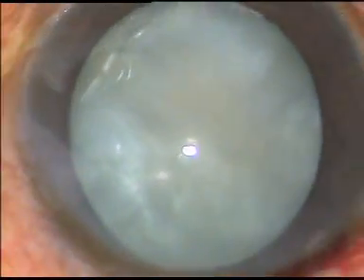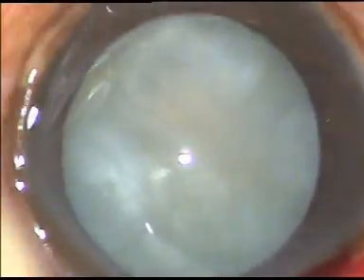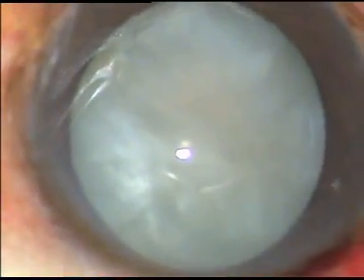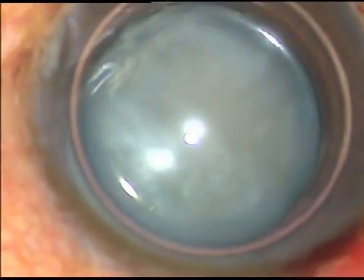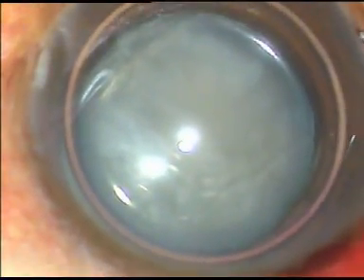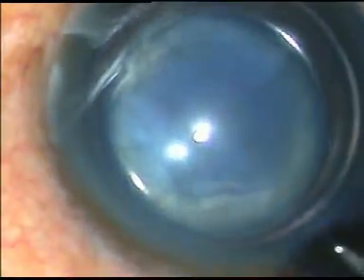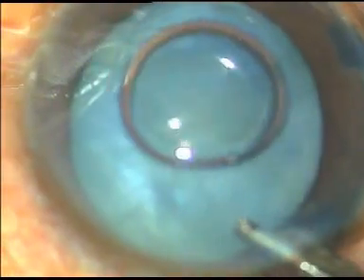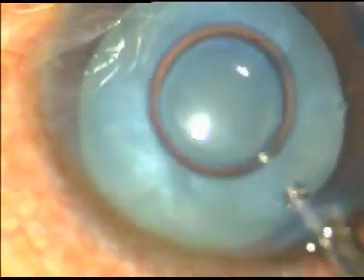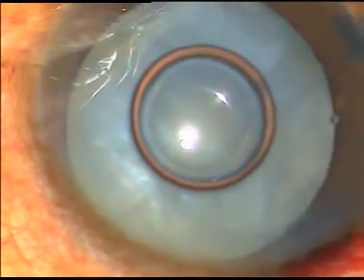The incision has been given at 11 o'clock and a side port is being made at 8 o'clock. A large air bubble is injected into the anterior chamber, and underneath this air bubble, the anterior capsule is stained with trypan blue dye using a 27-gauge cannula. The dye is then washed out with a direct Simcoe cannula, and viscoelastic substance is injected into the anterior chamber.